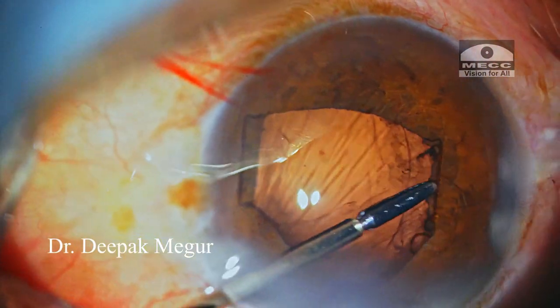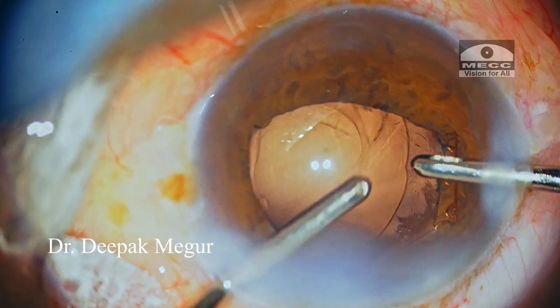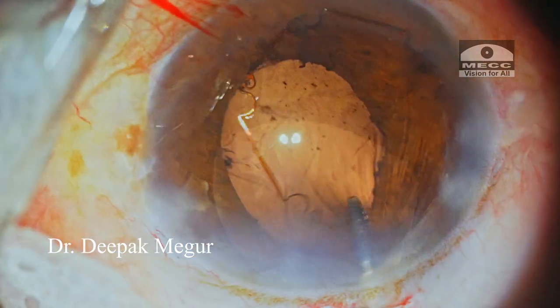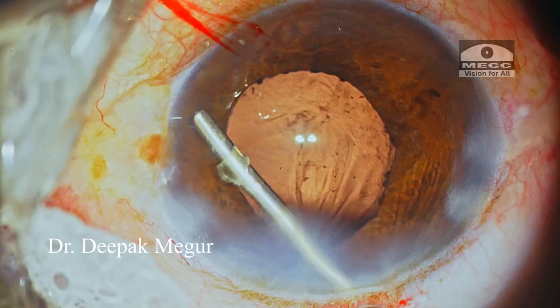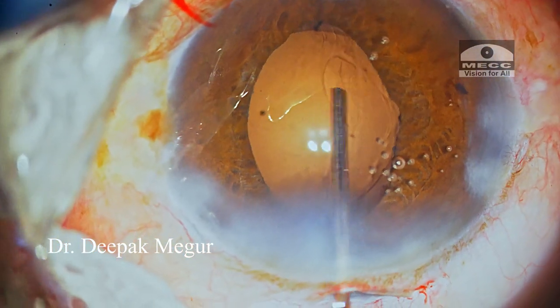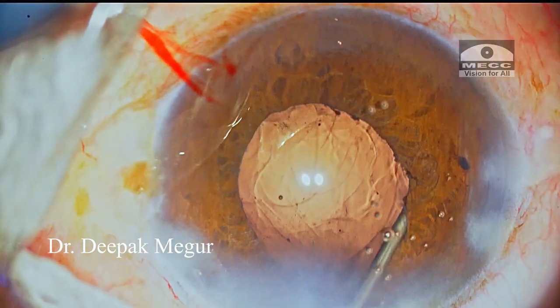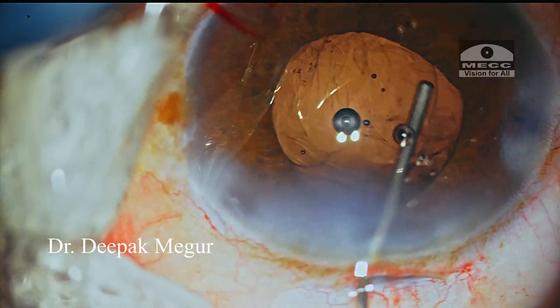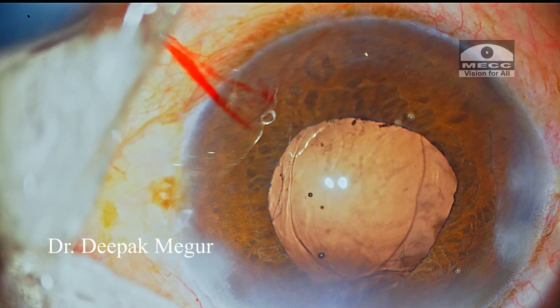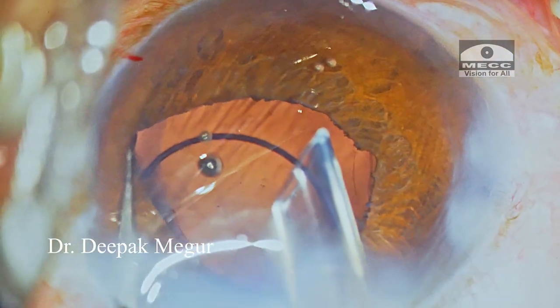At this moment, I realized that the B-hex ring had loosened off and slipped from the pupillary margin. I decided to remove it, hoping the pupil would remain the same size until completion of the surgery. Now is the time to implant the lens. My goal is to place the lens in the sulcus and later perform optic capture. Sodium hyaluronate is used above the anterior capsule to create some space. The distal haptic of the multi-piece lens is placed above the anterior capsule and the lens is dialed into the sulcus.